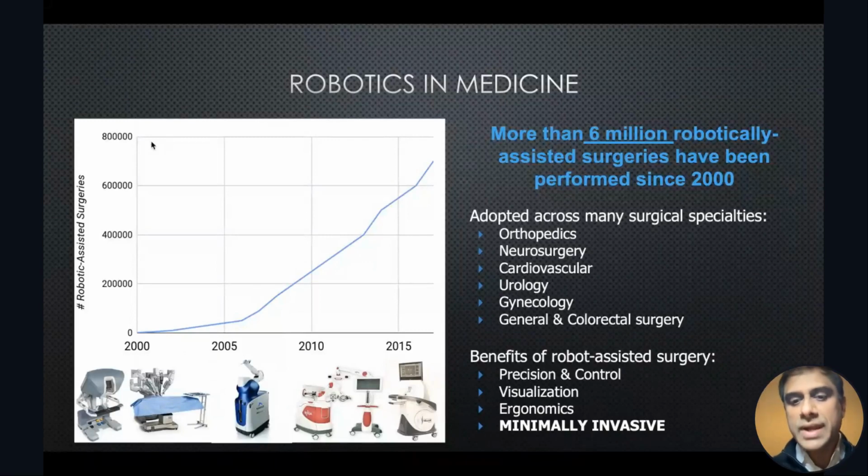So when patients come to our practices, and either the hygienist or the doctor is discussing their medical history, they say, yeah, I got a hip replacement done, I got this cardiac procedure done, and there was this amazing robot, it was so seamless, my experience was fantastic, and my recovery was fantastic. And now they're coming to you as a dentist, and you're talking about oral surgical procedures, and you say, okay, I'm going to flap open, I'm going to cut the bone, I'm going to place multiple implants, you're going to be stitched up, you're going to get all bruised and swollen, there's going to be some recovery time.